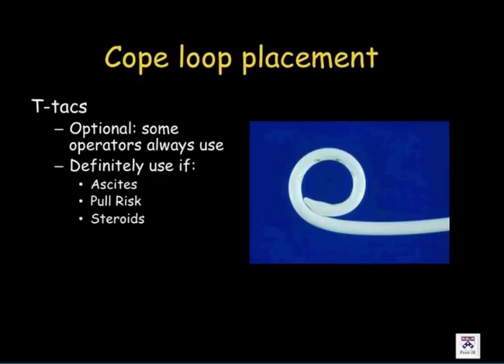But many years ago, if you just changed the size of the cut, you could attach your name to it. So this is the Deutsch gastrostomy tube. So 18 French, and this works very well. And our referring people thank us for placing much bigger tubes.